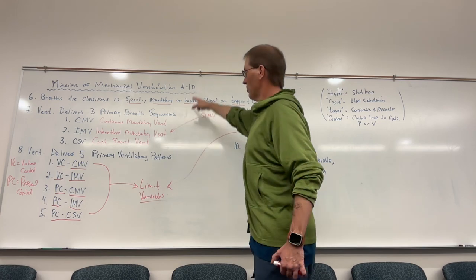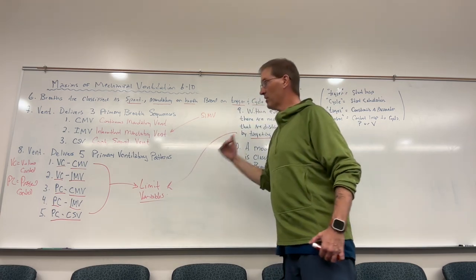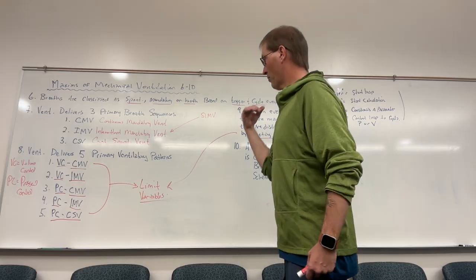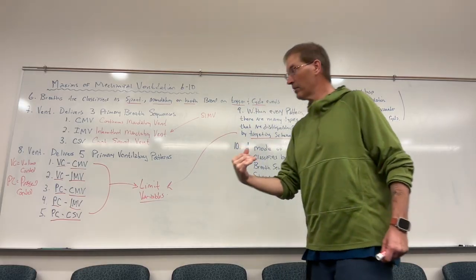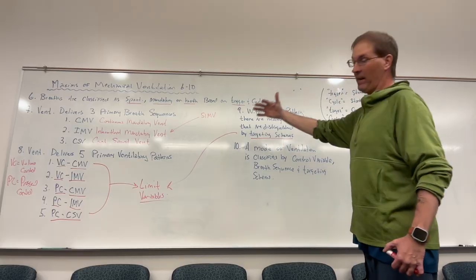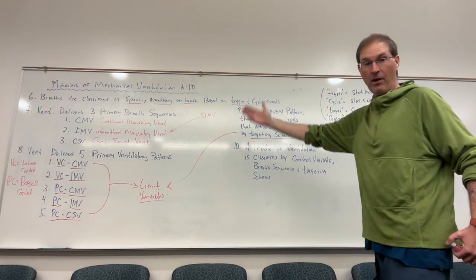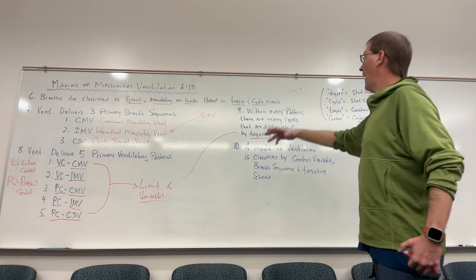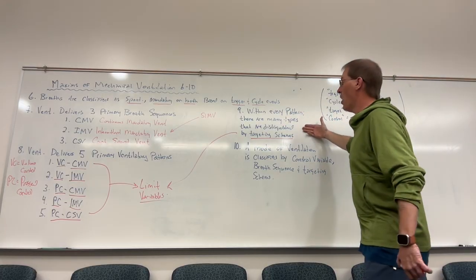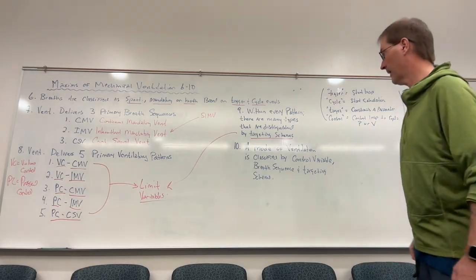And once you know this, you kind of know, okay, this is what the ventilator is using to cycle. This is the primary breath sequence and ventilatory pattern that it's producing. And now that I understand that fundamentally or foundationally, I can then take a deep dive into, okay, what is this specific mode targeting, okay?